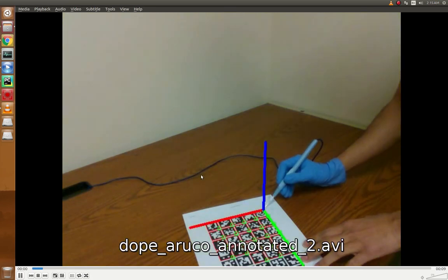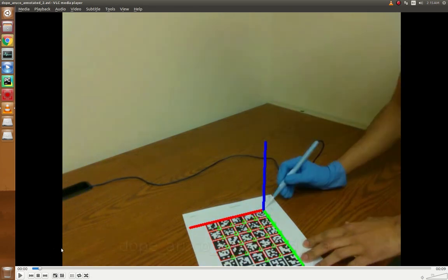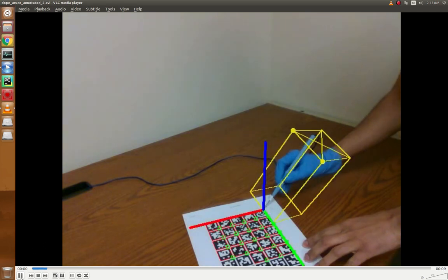So this is how the system looks like, the ground truth and the estimated things. This is the ground truth generator, this aruco-board. If you use OpenCV, you will always know the position or pose of this board, and from that you will always know the location of this aruco-board with respect to the camera coordinate system. And using DOPE I can estimate the tip's location.